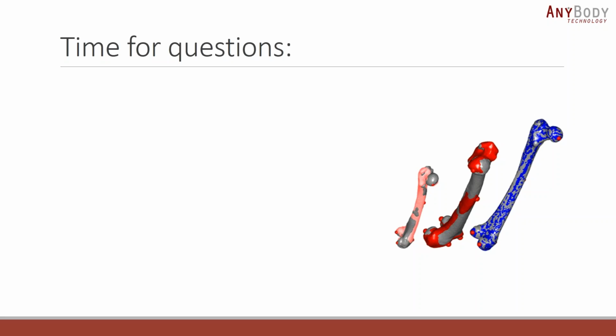I think it's quite difficult. Well, one way, of course, is if we look at the finite element models and how they, for example, estimate the mesh density, they have some sort of convergence analysis where they keep going until they converge to a certain value. I think in our case, it's a little bit more difficult to do something like that. Because of that, normally we stop at a certain level where we think the model is good enough.